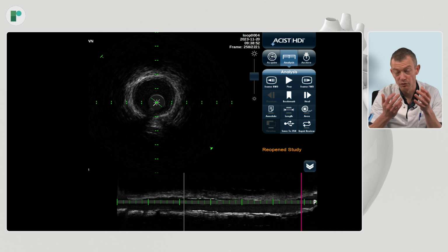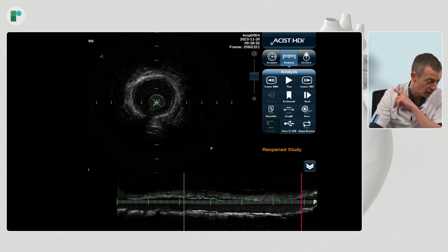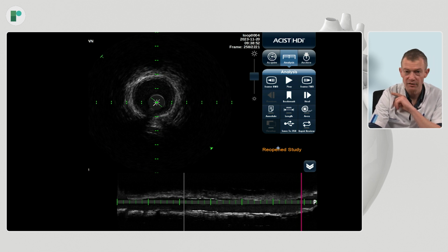Most of these stents that don't meet optimal stenting criteria, the issue is that the distal edge of the stent is containing more than 50% of plaque. So you would argue, well, how do I see it's 50%? Well, in this case, I think there's no single reason to measure, because you see that the vessel has a very thin wall, a thin walled appearance. I mean, the wall thickness is minimal, so there cannot be more than 50% plaque.